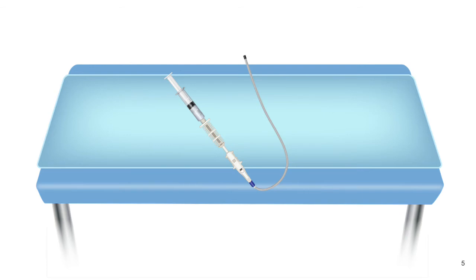It has an inner plastic tube with a needle at the end, and that inner plastic tube is enclosed in an outer plastic sheath. The needle is covered and protected by the outer plastic sheath. There is a technique to move the inner catheter out of that outer plastic sheath for the injection to happen.